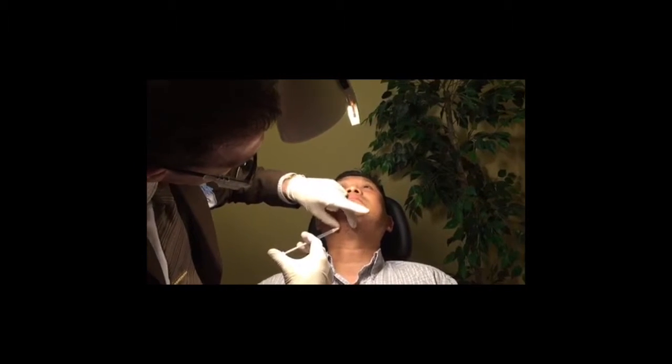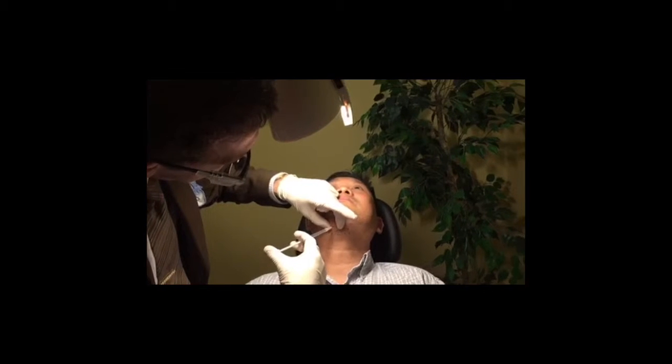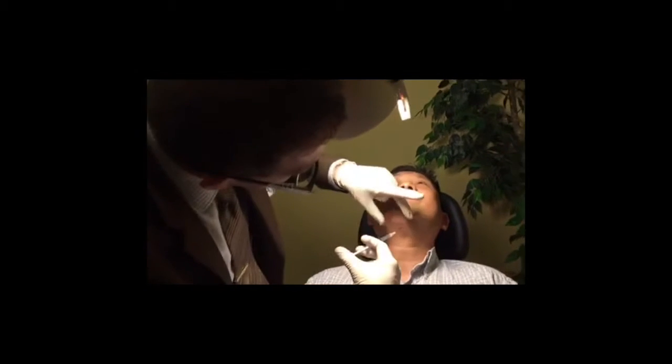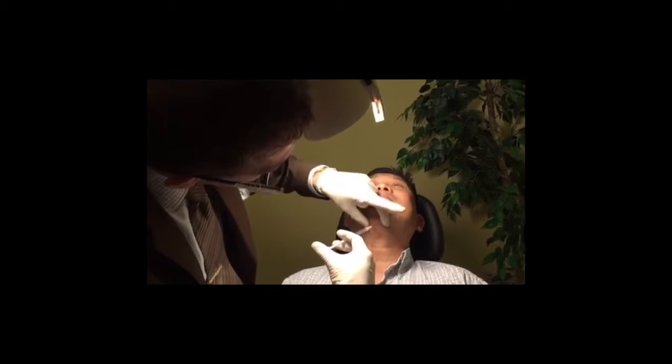And you're doing okay? Mm-hmm. Somebody asked, that looks like it hurts. And does it hurt? Not at all. Can't feel anything. Because of the numbing I did, he is comfortable.